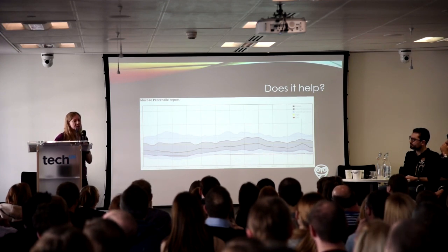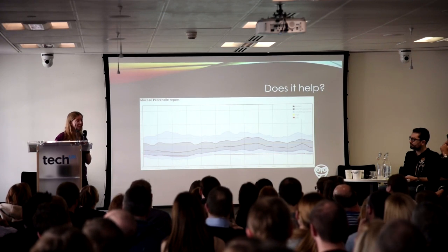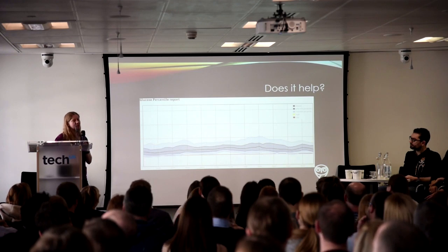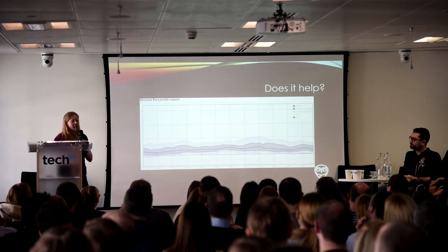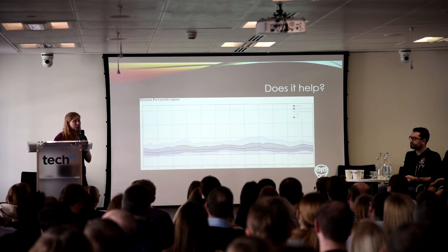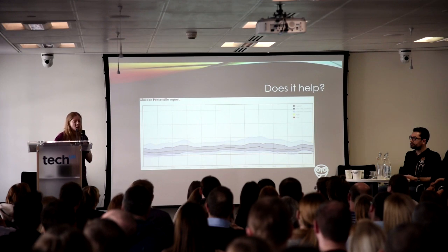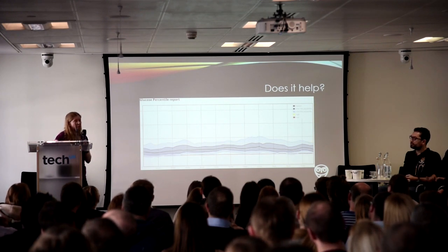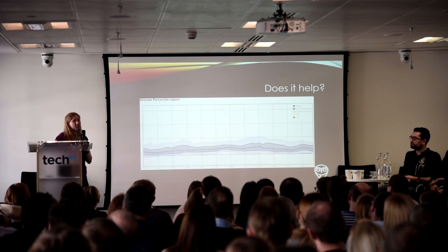My husband was in hospital, we started building an extension, there was lots of other stuff going on, and that's my 3 months after looping. The HbA1c was down to 5.4%, my average blood glucose was 6, but my standard deviation had lowered to 1.9. My median hypo value is 3.3, which is barely hypo. If I do have to treat a hypo, I only need 2 or 4 grams of glucose.